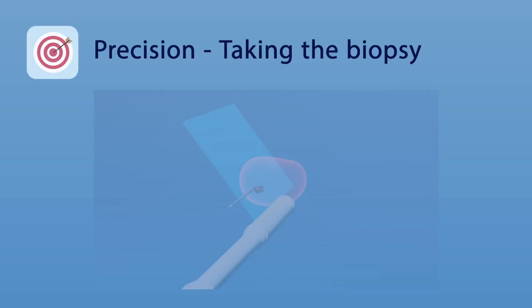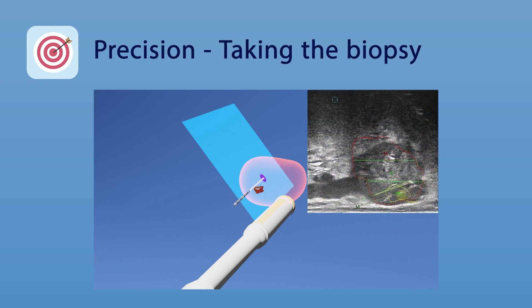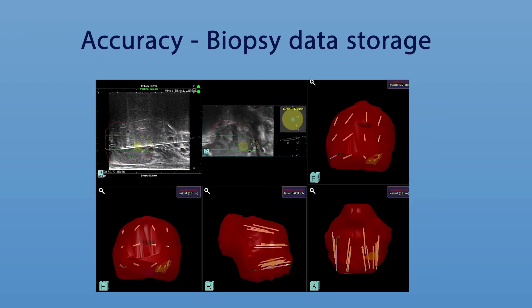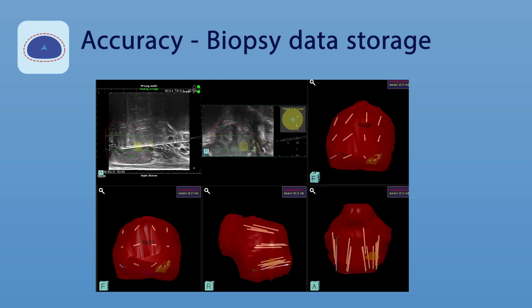The needle is moved to show its trajectory until this matches the earlier placed bullseye, then the biopsy is taken. The software moves to the next bullseye until all planned biopsies are taken. When finished, the procedure process can be stored for future review and treatment planning if desired.